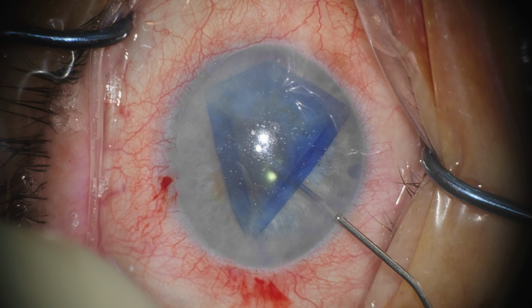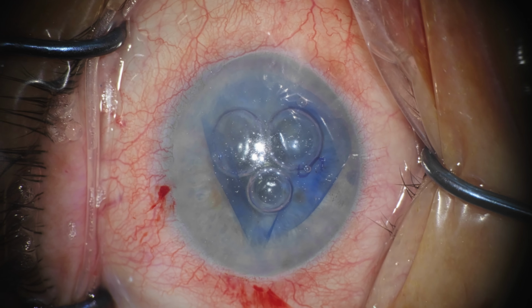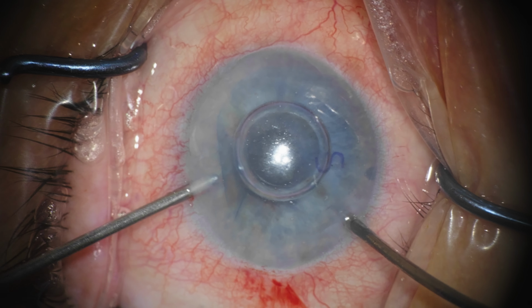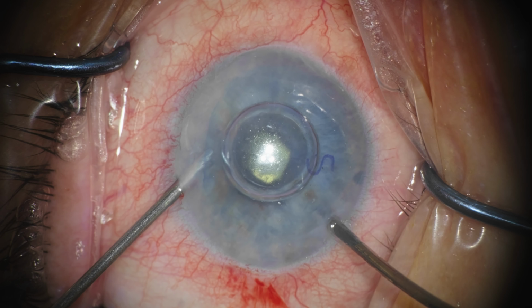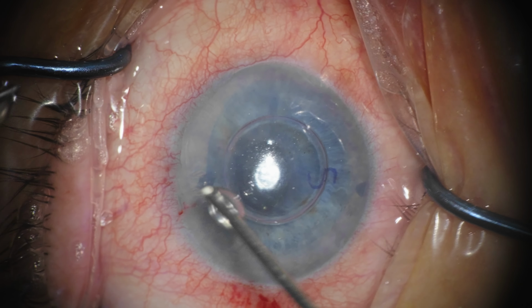And this is a winning configuration where we can inject an air bubble and lift the graft and handle the peripheral rolls with bumping, and in this case bubble bumping. But there's this roll at 12 o'clock that does not want to unroll. There was a bit of vitreous that was touching the graft and holding it in place.